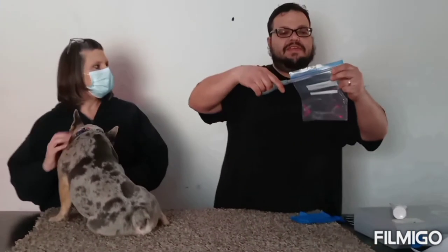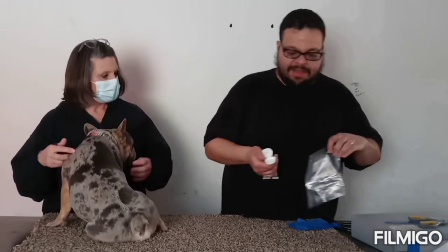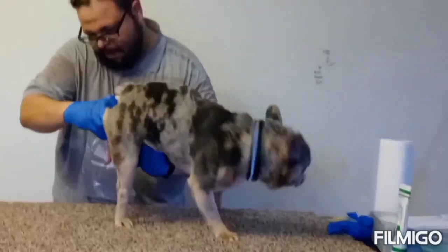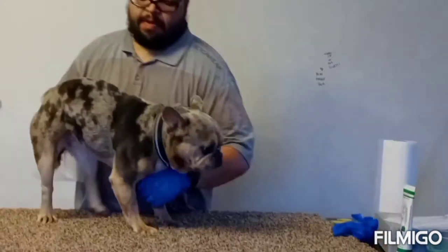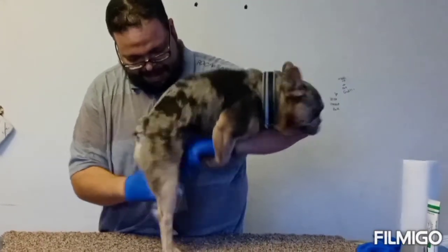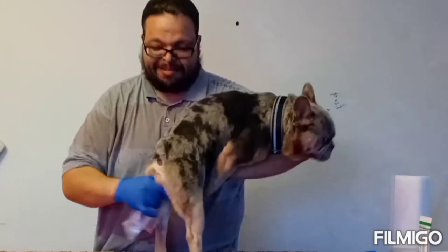We're going to use just a Ziploc bag — I like to cut the top off because it has those creases on it. We're going to use non-spermicidal lubricant, and I'll put all the links to this stuff below. I'm just going to fold over the top of the bag — this is just the way I found works best for me. I've got carpet which gives them grip for their feet, and you can use your arm like this, which seems to help a lot.